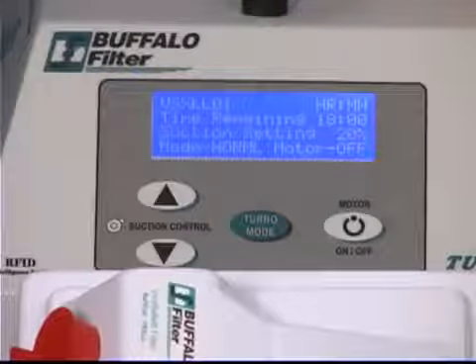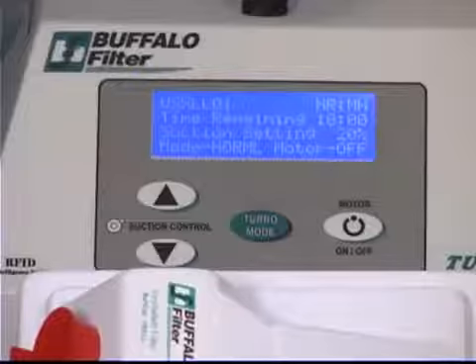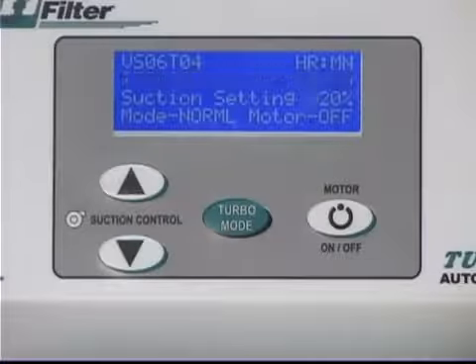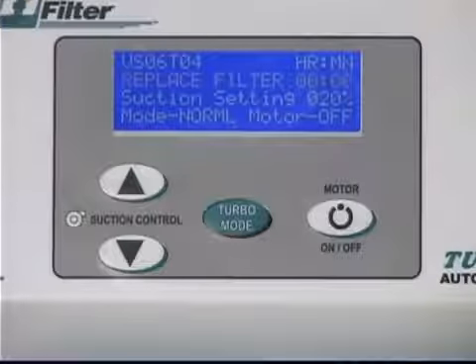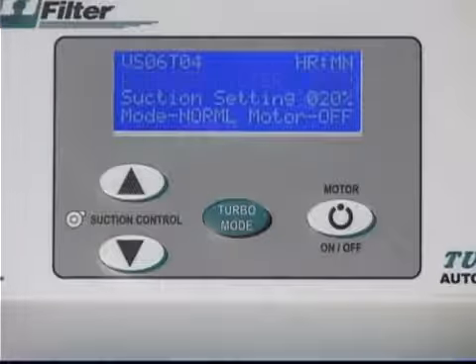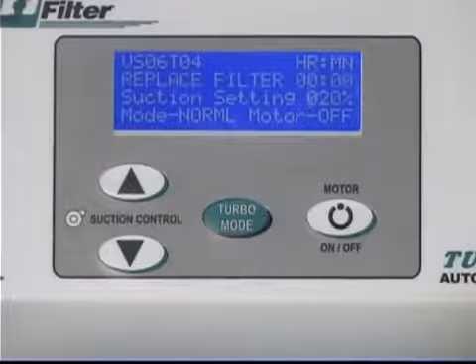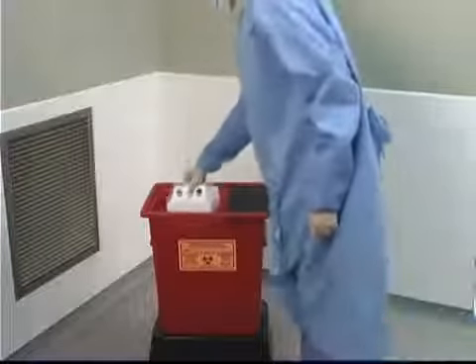The RFID technology will track the remaining life of the filter throughout its operational period in 1-minute increments. This will allow you to plan filter replacements and ordering. When the filter reaches 0 hours and 0 minutes, the display will flash to indicate that the filter has expired. The system will continue to operate until the main power is turned off, the filter is removed from the filter basket, or the system is left idle in standby mode for greater than 6 hours. This feature is incorporated to ensure that filter capture is not compromised, creating a hazard for either the smoke evacuation unit or, more importantly, the patient and OR staff. Expired filters should be treated as biohazardous waste and disposed of according to facility protocol.